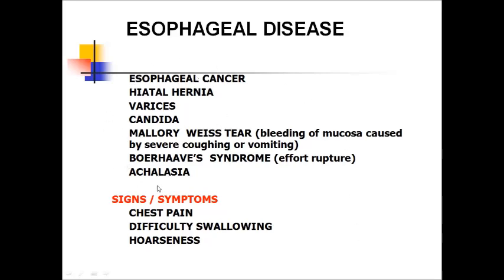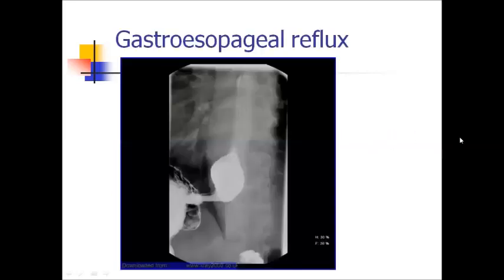and all the different pathologies usually present with three groups of symptoms. It's chest pain, difficulty of swallowing, and hoarseness. So let's observe some, not all these pathologies, but some of them. Gastroesophageal reflux, very frequent finding in barium swallowing for esophageal examination.